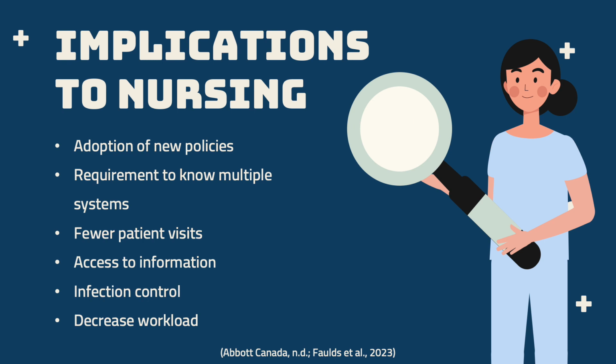Nurses have a duty to ensure they have the necessary knowledge and competence to provide patients and their families with adequate teaching surrounding continuous glucose monitoring usage, troubleshooting, integrated technology, and diabetes self-management. With many different monitor models on the market, specific features and designs for each system require ongoing learning. Nurses should follow organizational policies and refer to the manufacturer websites that provide resources for frequently asked questions and troubleshooting.